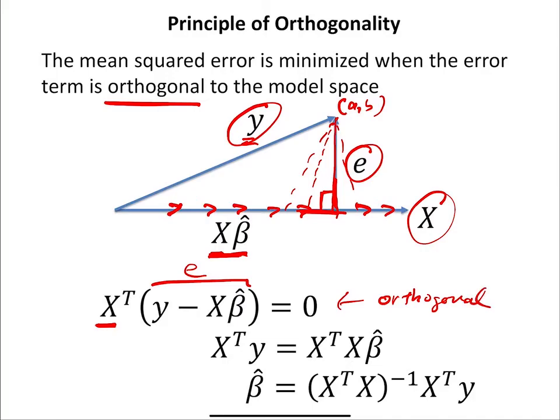If I solve that, I get what's called the least squares solution. I can estimate beta hat from the design matrix times my data. AFNI, FSL, SPM, they're all doing this exact mathematical operation. You have to supply the data, and you have to tell it something about the design matrix, which is typically just the timing.